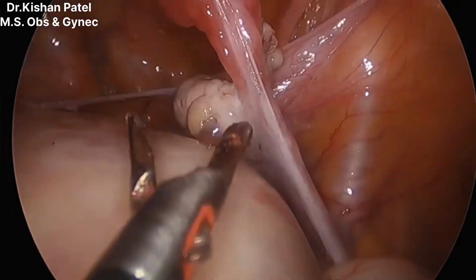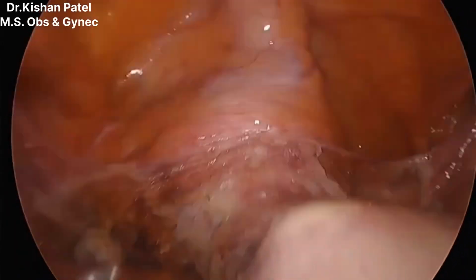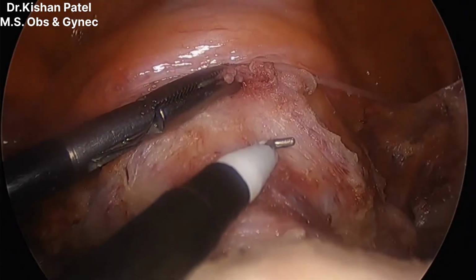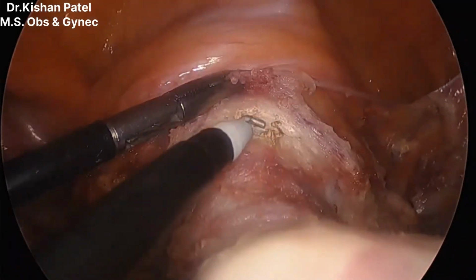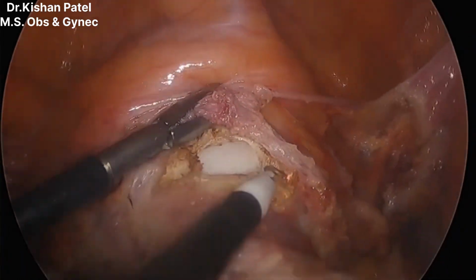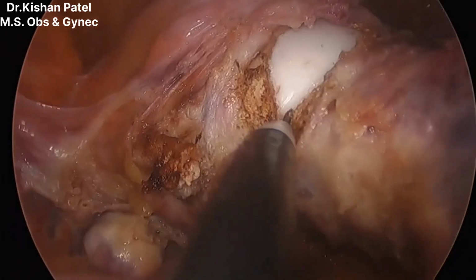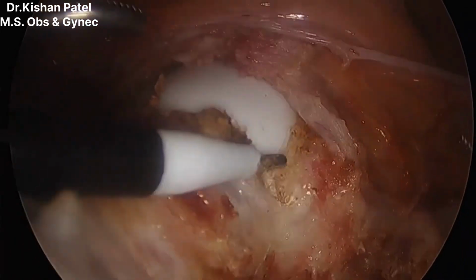We have removed the left fallopian tube. Now we are going to remove the right fallopian tube, so we can remove it at one time with the uterus. With the monopolar cautery, we will do the colpotomy with the monopolar hook. I am coagulating and cutting. You can appreciate the vaginal manipulator seen, white color. I am going from center to left, then going from center to right, matching with the opposite side.